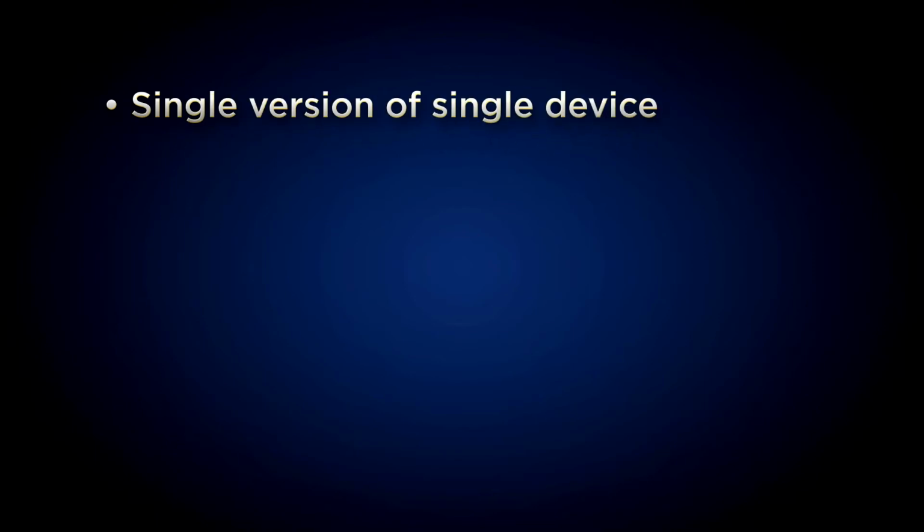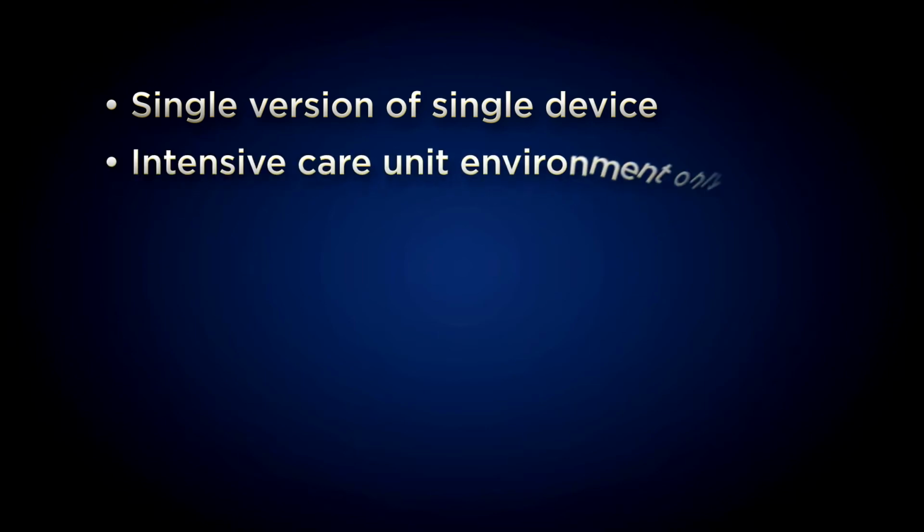the time. It is important to note that we tested only a single version of a single device, and algorithm detection is always improving. Our study took place in the ICU, and the results do not apply to other environments, such as the operating room, in which cerebral NIRS has been extremely well validated as a predictive screening tool.